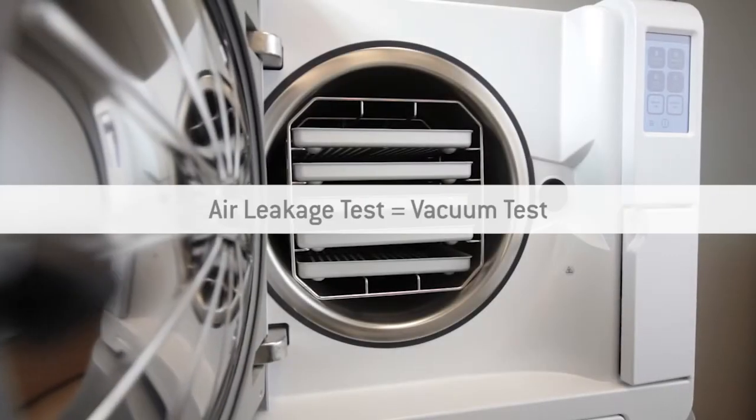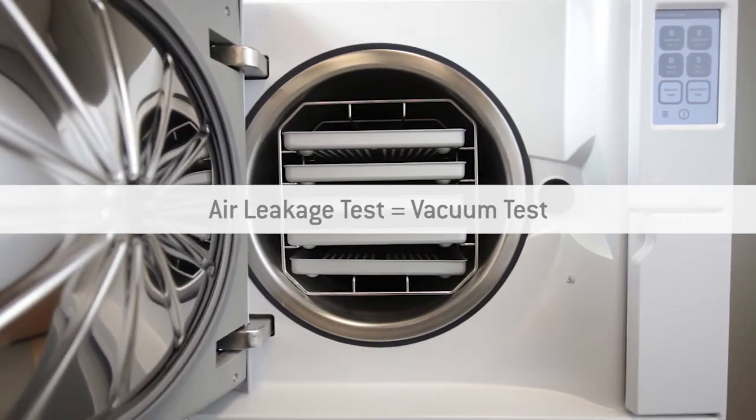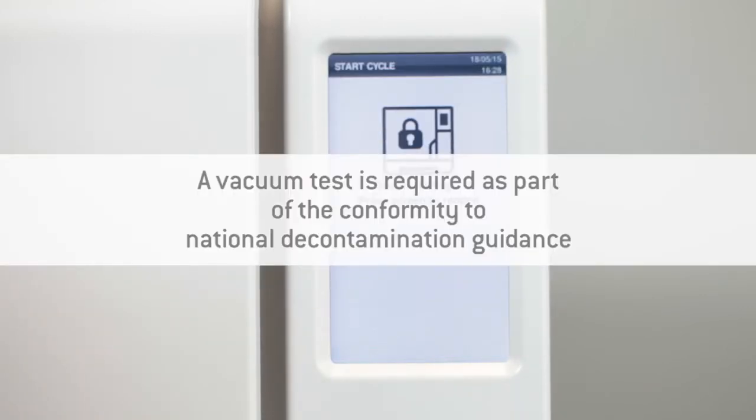The Leaser air leakage test is referred to as a vacuum test. The vacuum test can be found in the cycle selection screen. A vacuum test is required in accordance with the National Hygiene and Decontamination Guidelines. It tests the integrity of the Leaser sterilizer's closed pneumatic circuit and the vacuum pump performance.